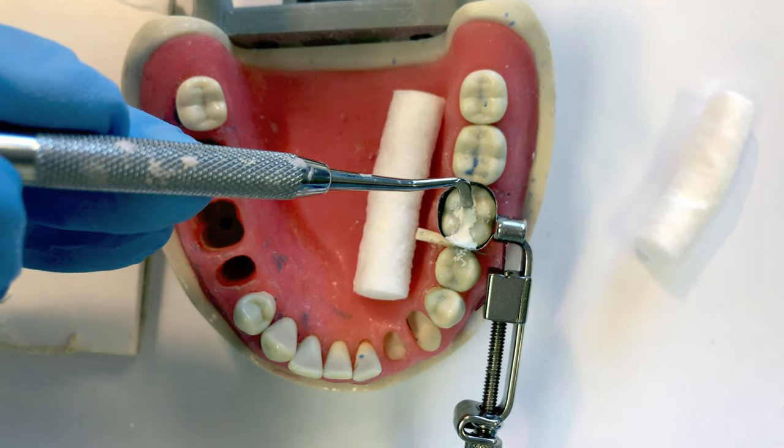After the initial set, remove the matrix band. Always keep your finger over the occlusal surface of the band and remove the retainer first. Loosen that outer knob — that will release the spindle from the vice box — and just pull the retainer away. Next, take out the cotton roll, then use your cotton pliers to remove the wedge.